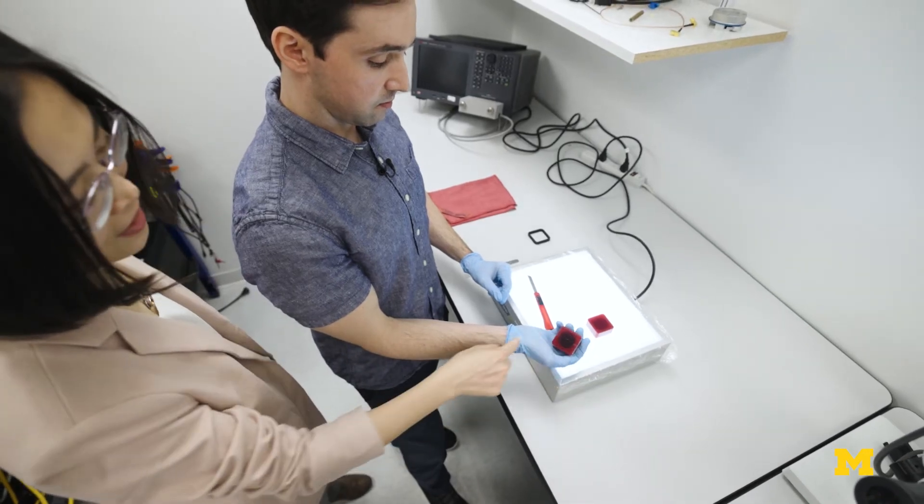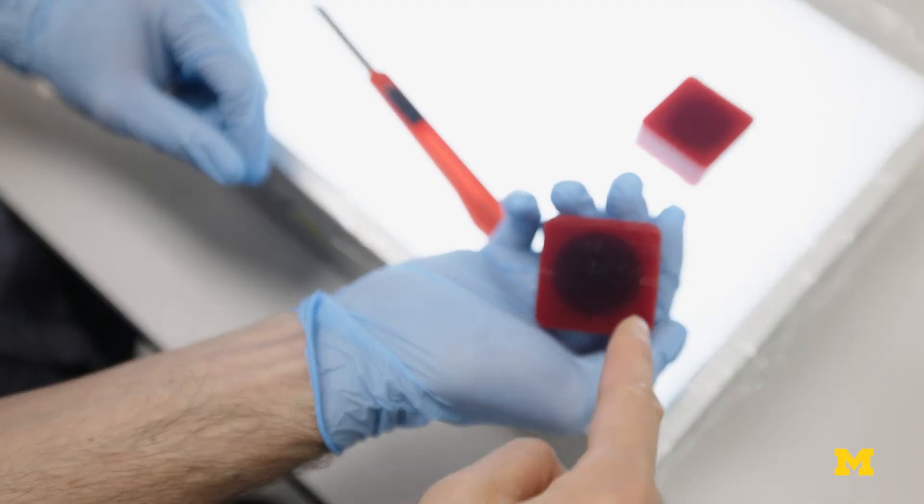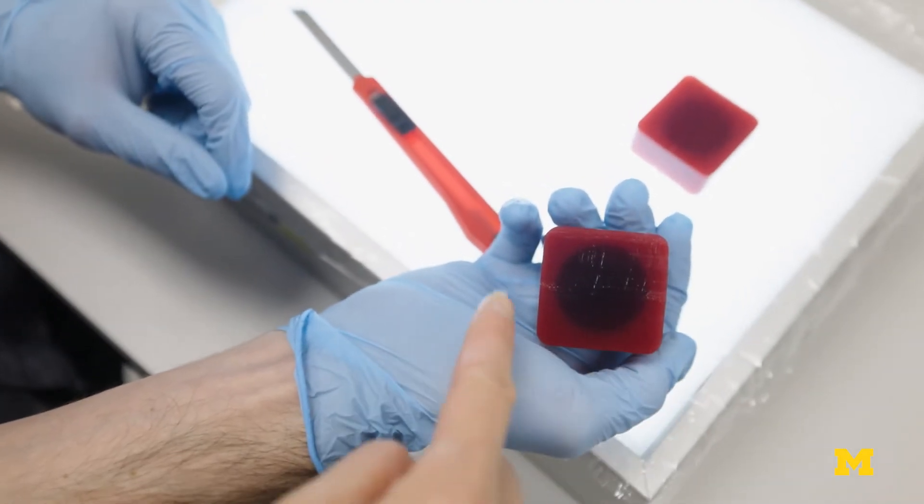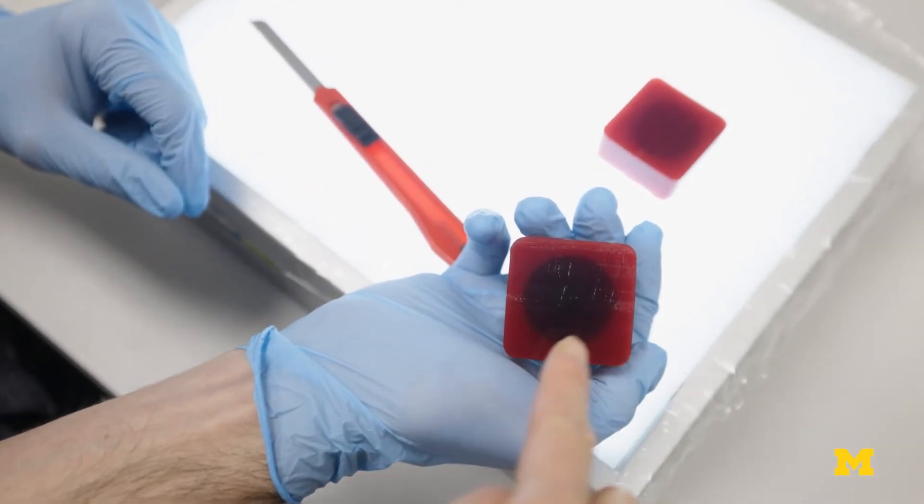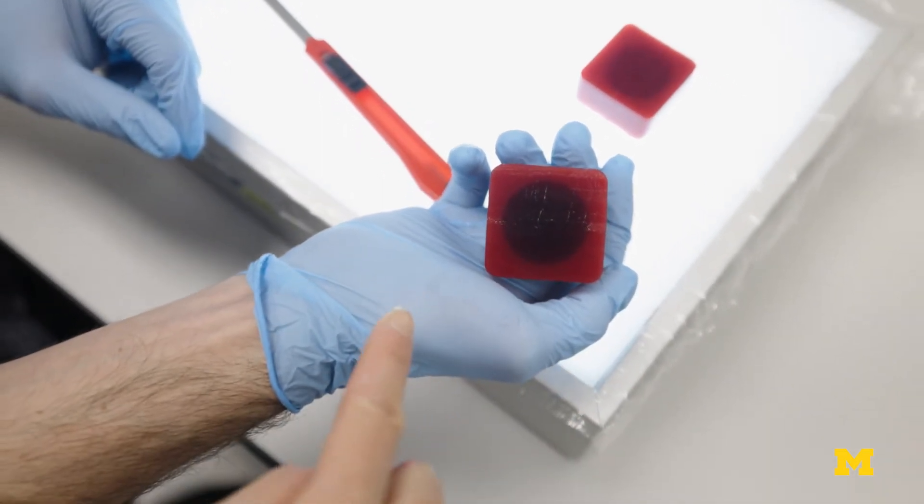This is a treatment region. This is a dark color ablation zone. Outside the spherical region, there's no other dark color zone indicating there's nothing getting damaged.